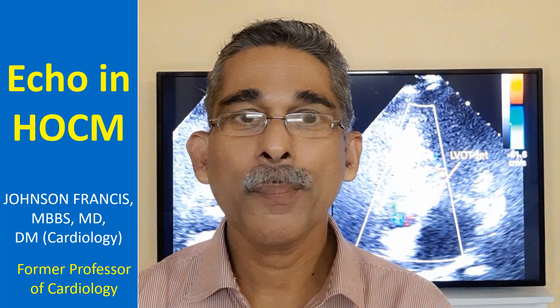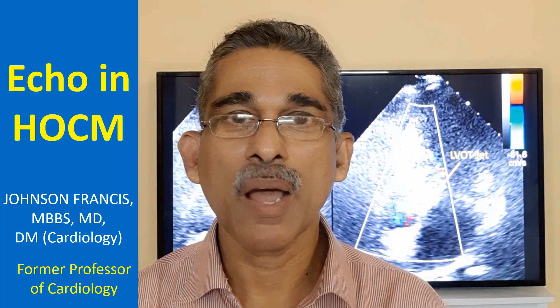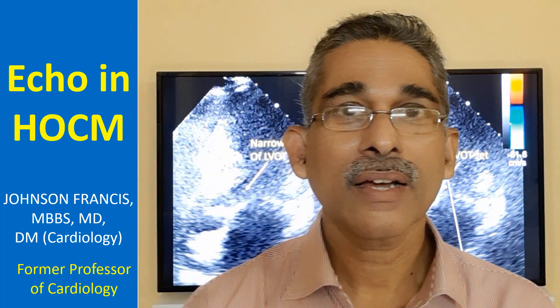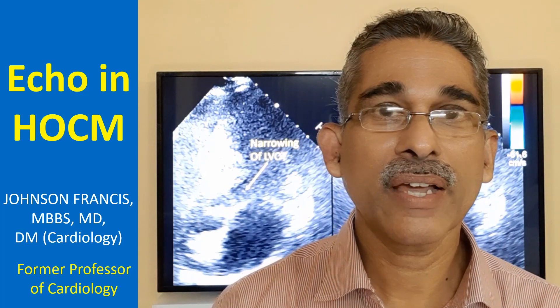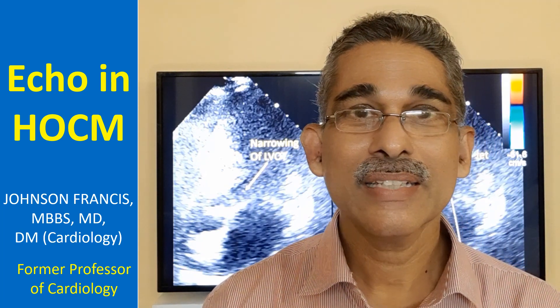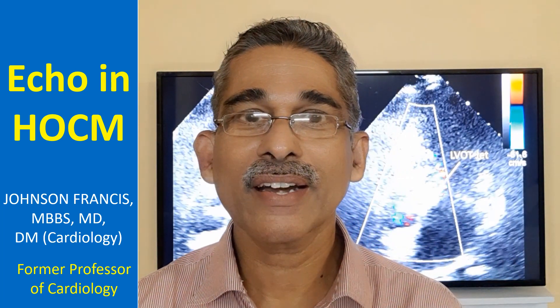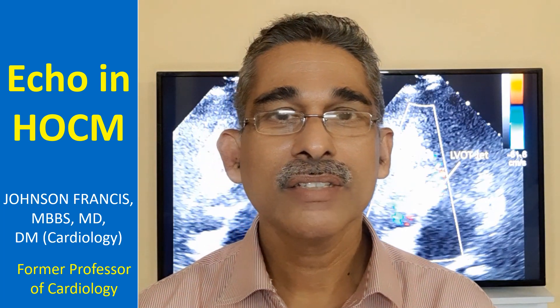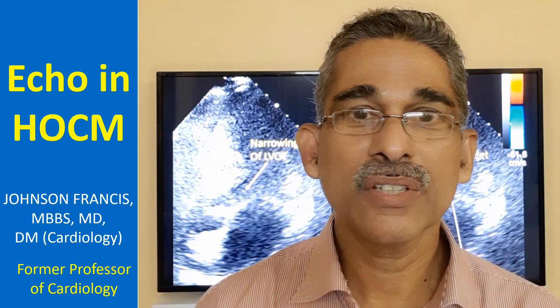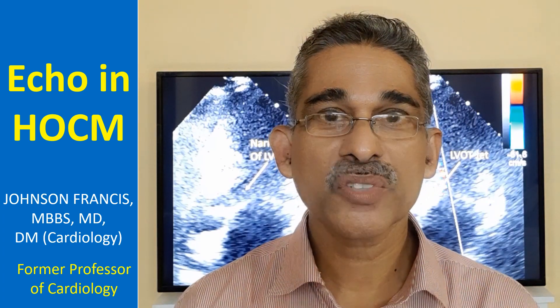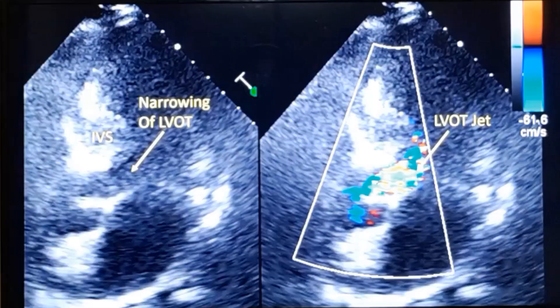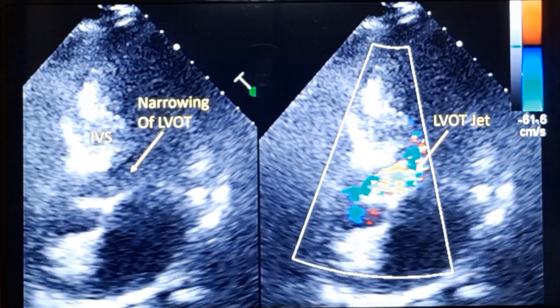Now we'll discuss some echocardiographic features of hypertrophic obstructive cardiomyopathy. The most important feature is asymmetric septal hypertrophy, which produces a narrowing of the left ventricular outflow tract, responsible for the obstructive features of hypertrophic obstructive cardiomyopathy. This is an apical 5-chamber view in hypertrophic obstructive cardiomyopathy.